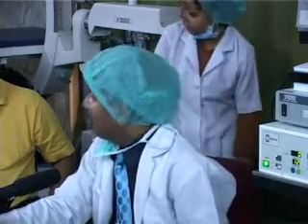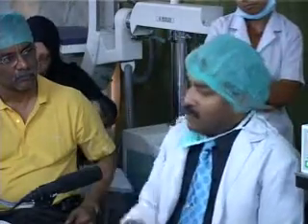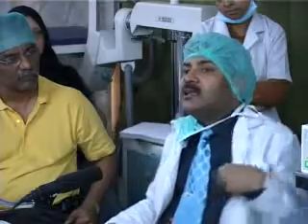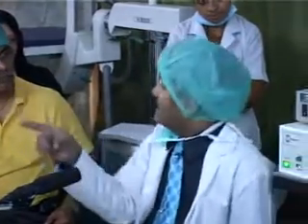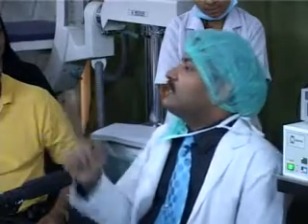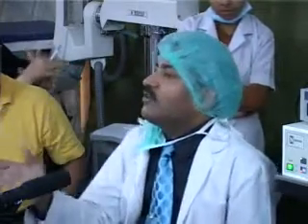Generally these things need a little experience. If you do not have that much experience, take the gas out. If your cannula is still there, take the telescope out, open the valve of the cannula — everything is out — then take the cannula out and go with the Palmer's point. Because now if you enter through the Palmer's point, you can see the adhesion also and differentiate, and you can find out your own complication. Sometime if you enter from here, you cannot see the complication. Even if you have perforated the omentum or a bowel loop, you cannot identify it.